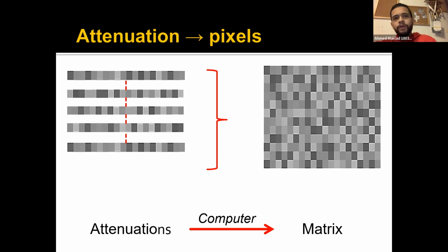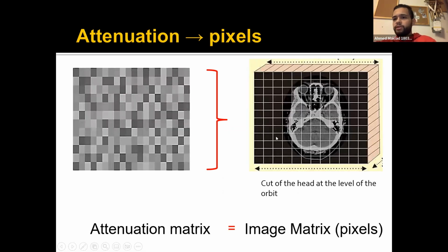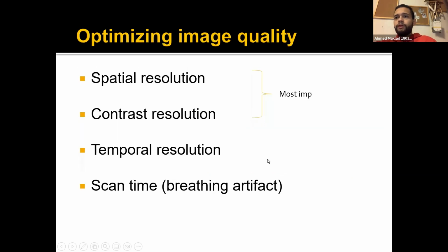the result. Right, so the multiple views you get from the X-ray tube as it keeps moving will be merged together to give you a matrix, right? And this is basically what you see. You will get this, all right?